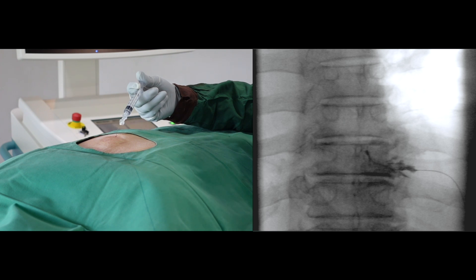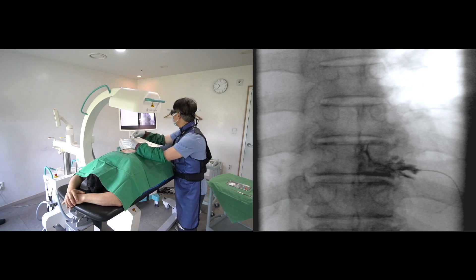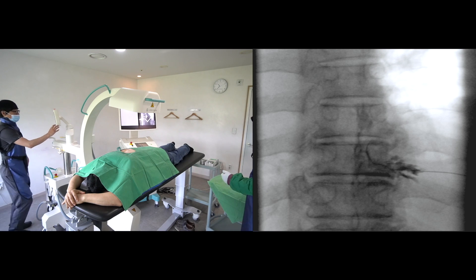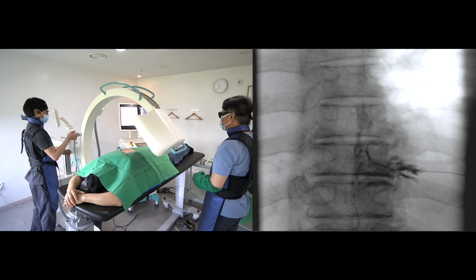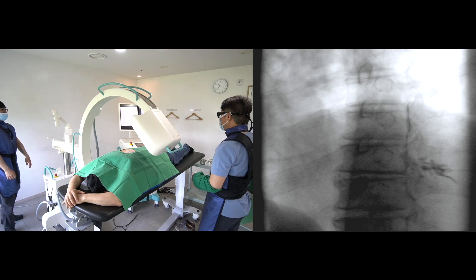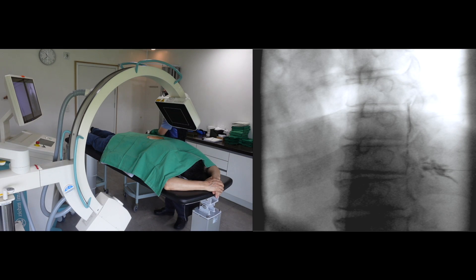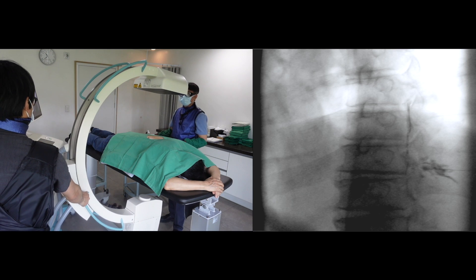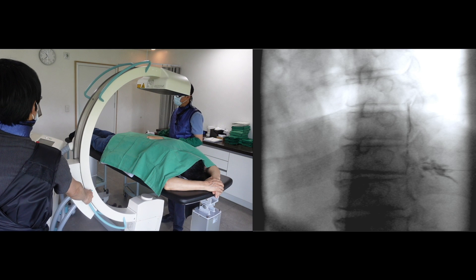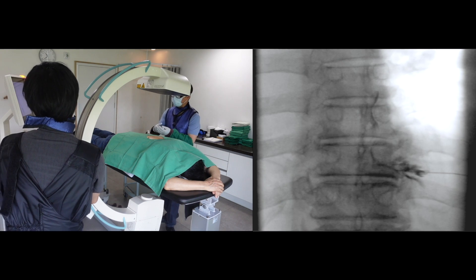I think the contrast spread is okay. I'll show you the contrast media spread on the contralateral oblique image. Please keep the contrast pattern in mind. Previously, I mentioned the yellow line connecting the internal aspect of the pedicle.